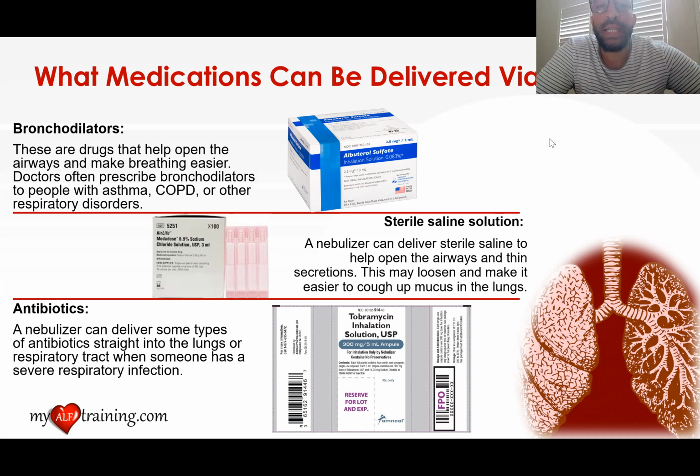So a sterile saline solution is very common, something we administer all the time. It's just like a fine mist, and it goes inside the lungs, breaks up the mucus, and this can do wonders for your patient if they're having a lot of trouble with mucus and they can't bring it up, or they're coughing and they're not bringing up the mucus, it's just saliva, but they feel like they have mucus.